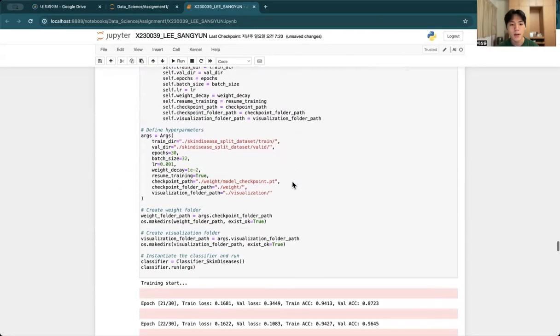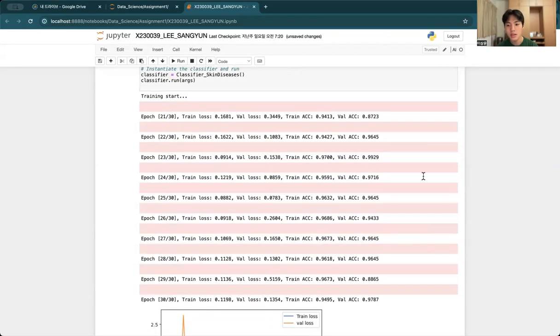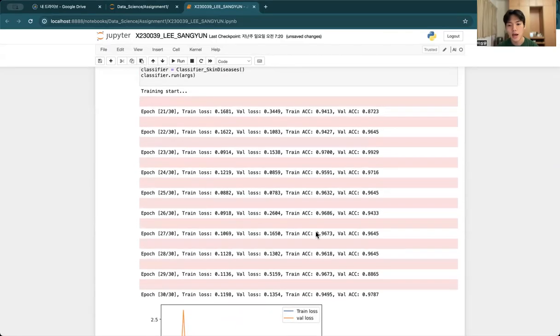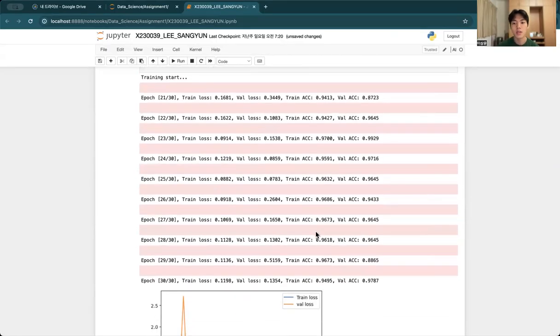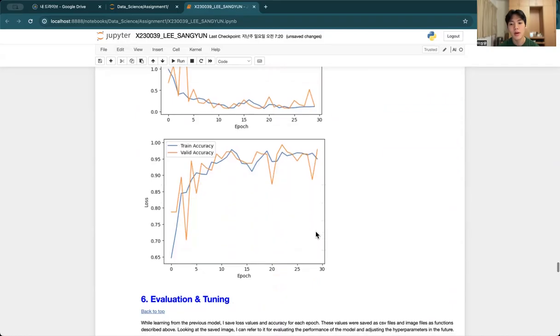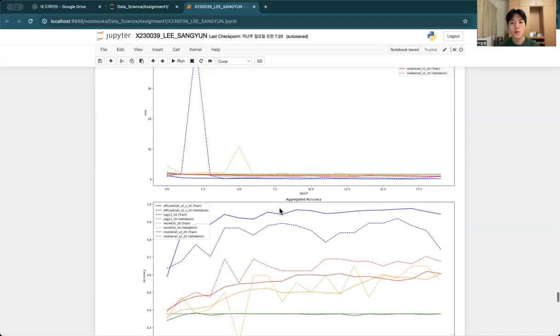So now I can train the model, and I already trained it. I use four models to decide which model is the best. I have already trained the models and saved the loss value and accuracy value for each epoch. I will select a model by looking at the visualization data. There are four model histories in the following code. The results of the training epochs per model were combined and visualized.